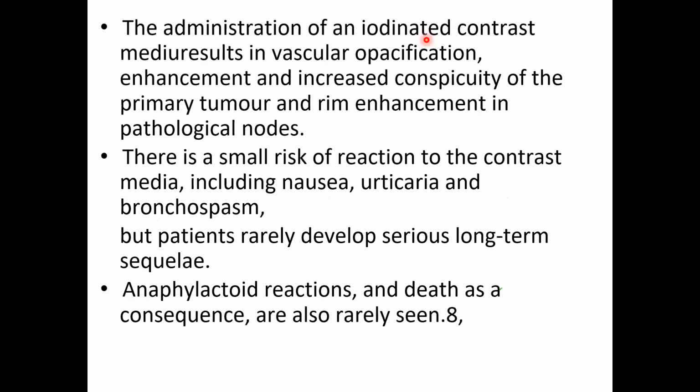The administration of an iodinated contrast medium results in vascular opacification, enhancement, and increased conspicuity of the primary tumor and rim enhancement in pathological nodes. There is a small risk of reaction to the contrast media, including nausea, urticaria, and bronchospasm, but patients rarely develop serious long-term sequelae. Anaphylactoid reactions and death as a consequence are also rarely seen.